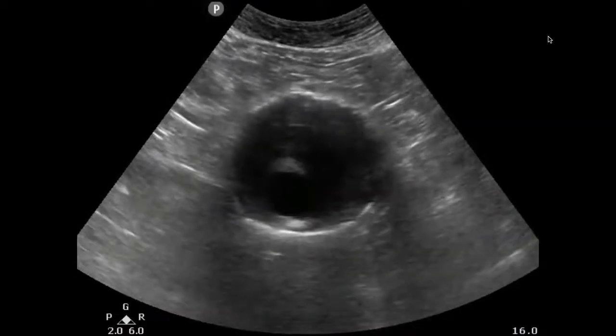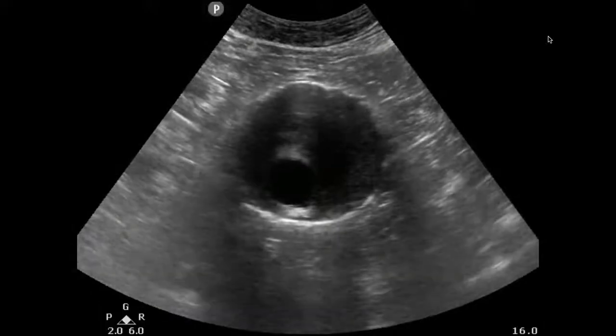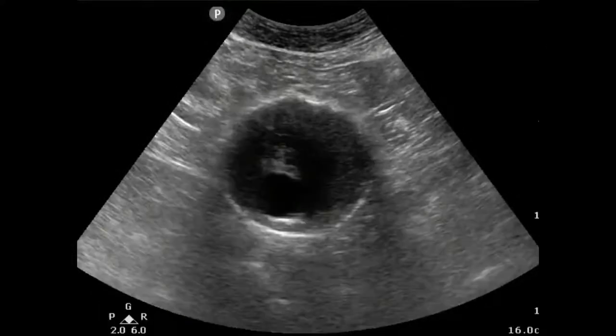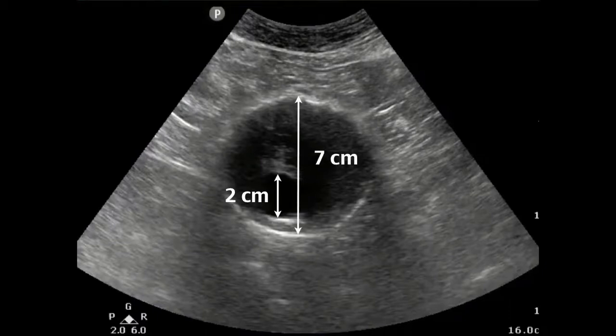This is what an abnormal aorta looks like. It's important to understand that the lumen and the outer wall-to-outer wall are not the exact same measurement. If we only measured the inner lumen, we would say this is 2 centimeters — not quite AAA — but measuring outer wall-to-outer wall shows 7 centimeters, which is definitely an abnormal finding.